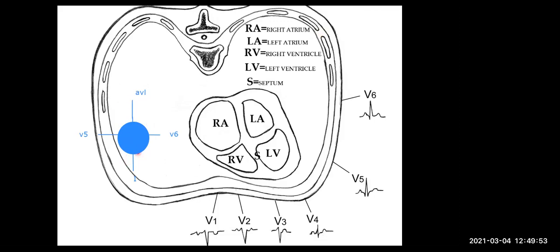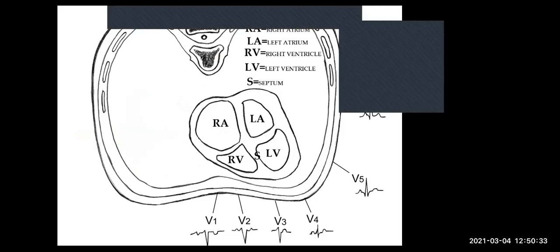So we've got this left ventricle, or this left side of the ventricle. So we've got V5 and V6 looking at it from this angle, and we've got lead 1 and AVL. So we expect these 4 to give us a similar picture because they're all looking at the left side of the heart, just from slightly different points of view. So sometimes they don't always match up, and sometimes it's more the high lateral side that's affected, and sometimes it's more on this plane of V5 and V6. Okay. All right. So I just wanted you guys to have a look at that, just so that you understand it. So let's just hide this again as we're going through.